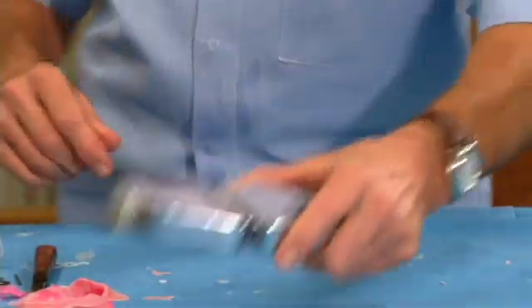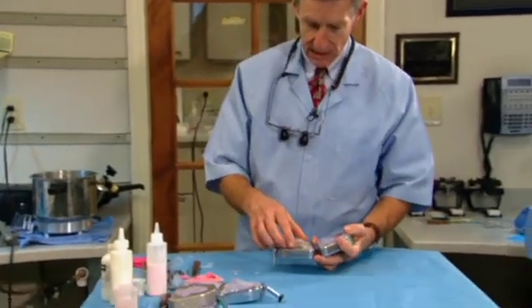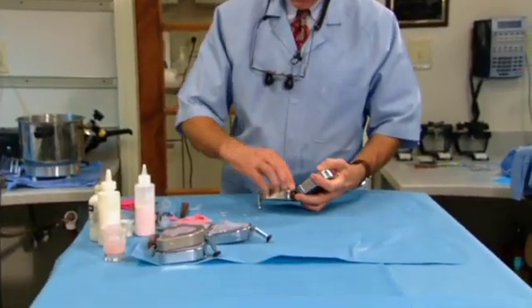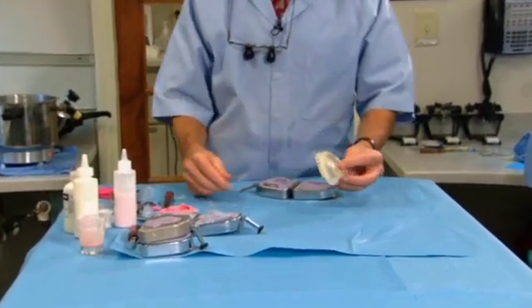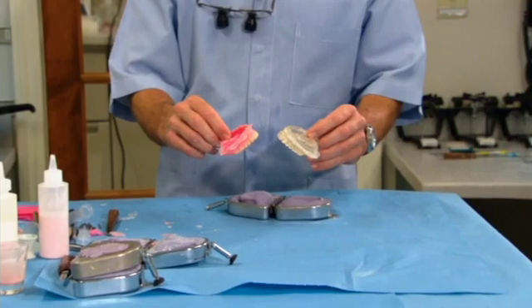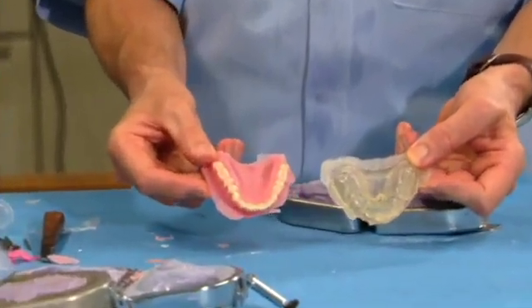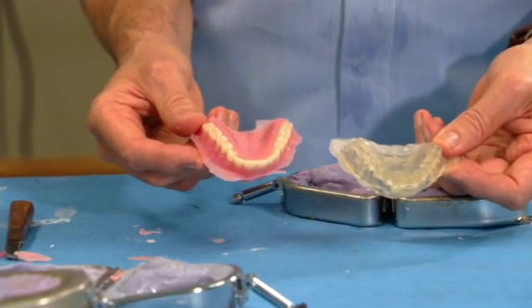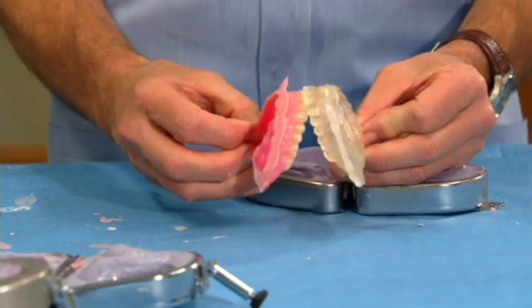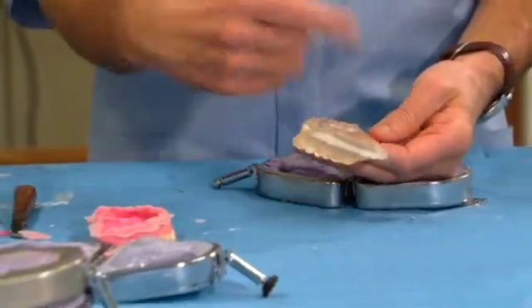I'm going to pull out the clear duplicate that we made for Mr. Bothy. And as I showed you mixing the clear, it's going to look almost exactly the same as the duplicate in pink and tooth colored. So there's our clear duplicate. We would use this, as I said, if we wanted to make him a new denture based off of his old denture, we could wash reline this.